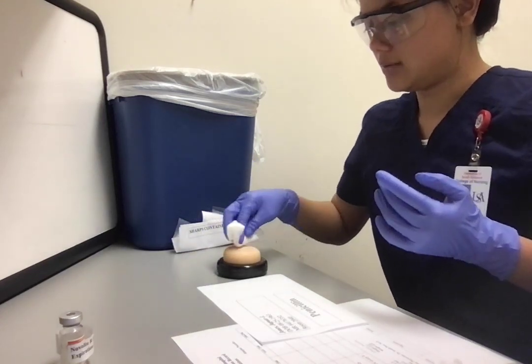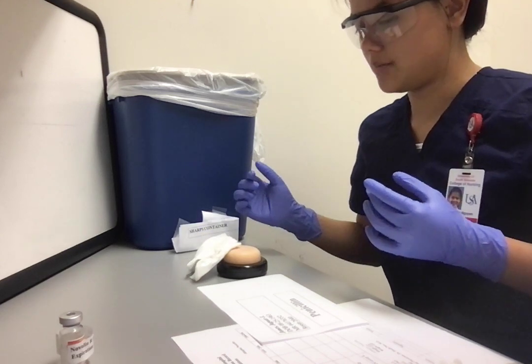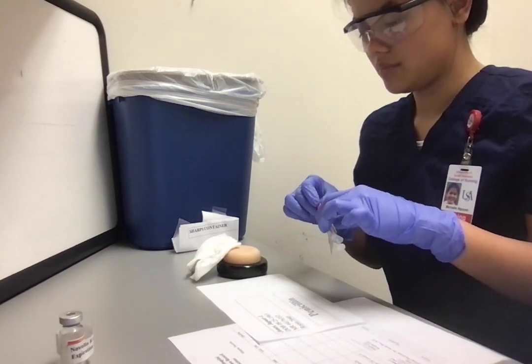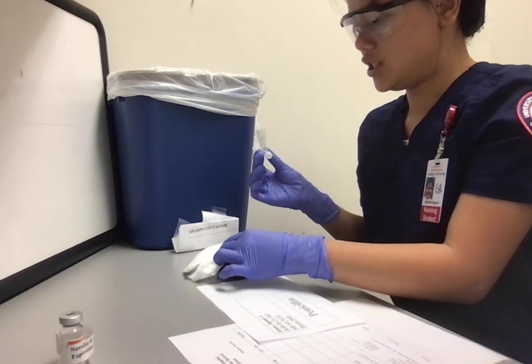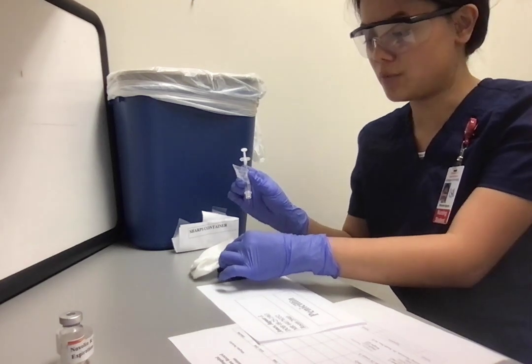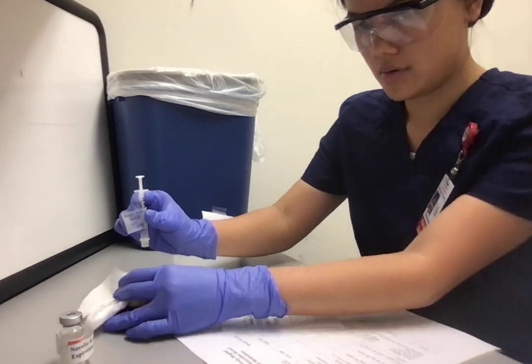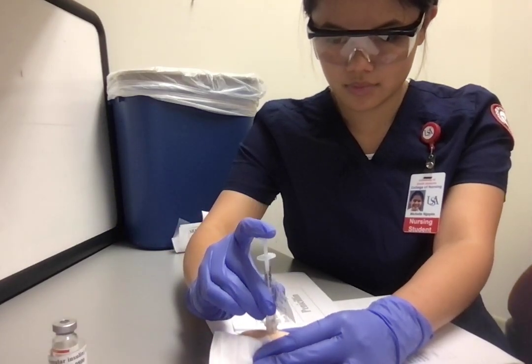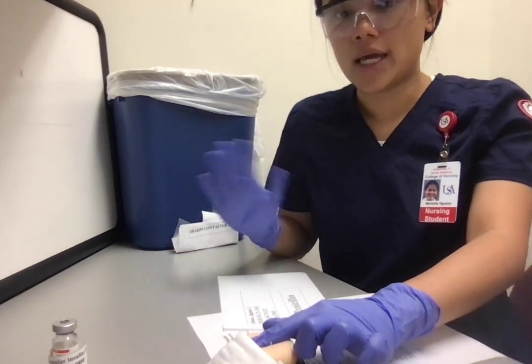So I'm going to clean. I'm going to use this to point my injection site. Going to pinch the skin, and either I can go at a 45 or 90 degree angle, but I'm going to go at a 90 degree angle. Okay, so I'm going to apply pressure and not massage the site.